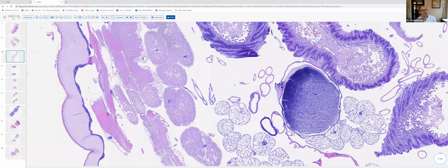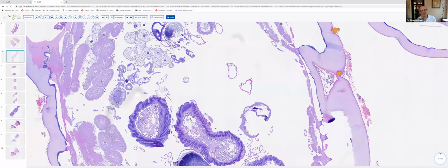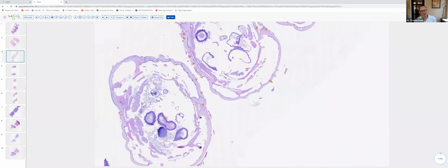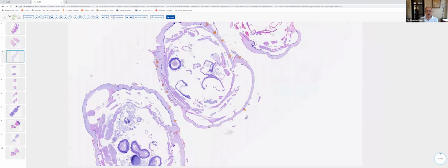So it's the combination of this thick chitinous wall, coupled with especially the ochre-colored setae and the skeletal muscle and integument that are characteristic of a botfly larva. Another organism which is quite large and has a similar configuration would be the gravid sandflea causing tungiasis. However, it lacks the ochre-colored setae that are so distinctive of the botfly larva.